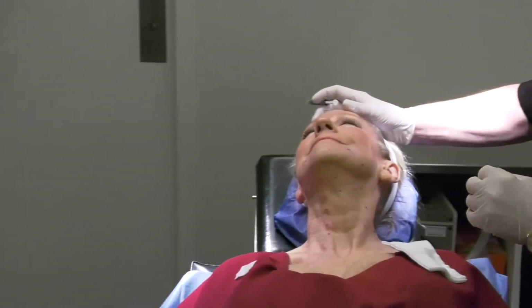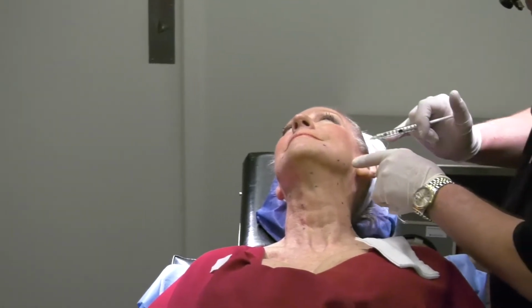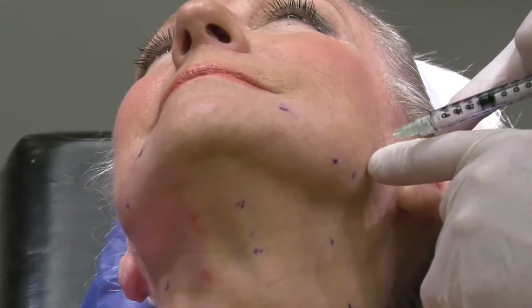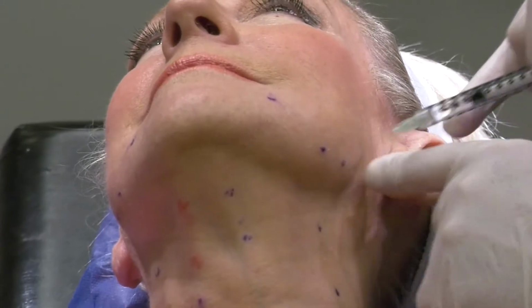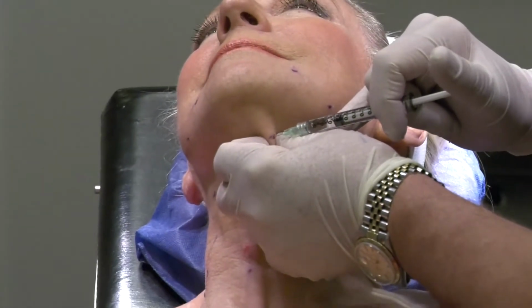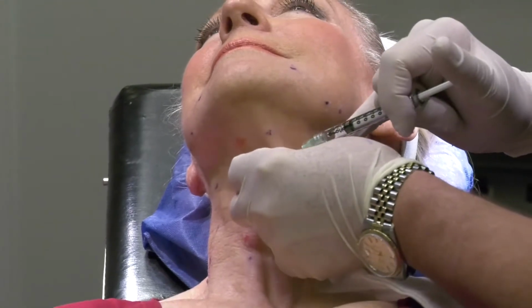Just turn your head a little bit to the right. Again, insertion onto the mandible, 2 unit injections in each point. Again, picking up the platysmal muscle and keeping it away from the underlying musculature.